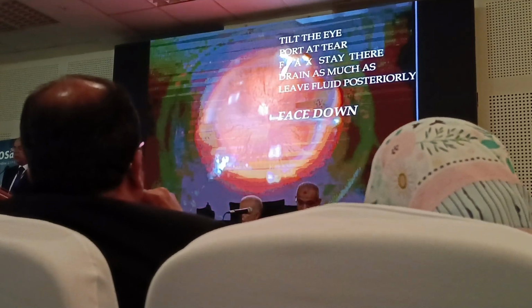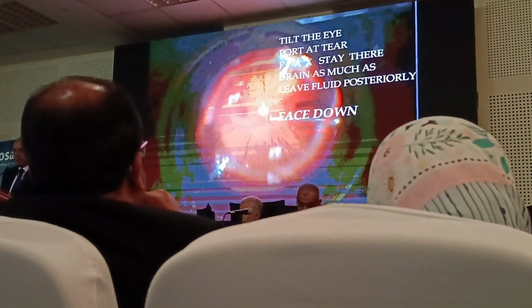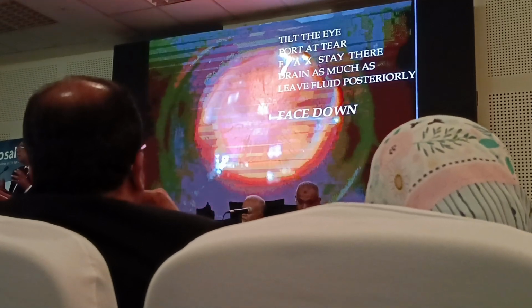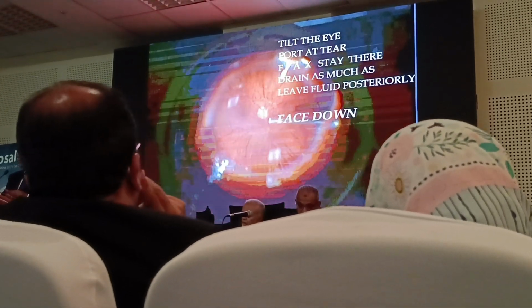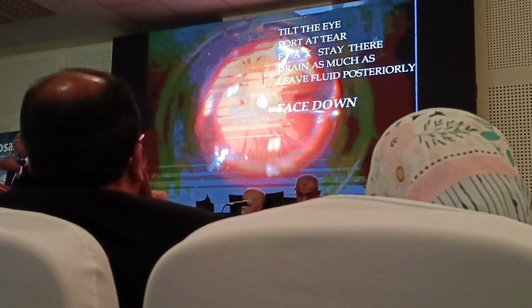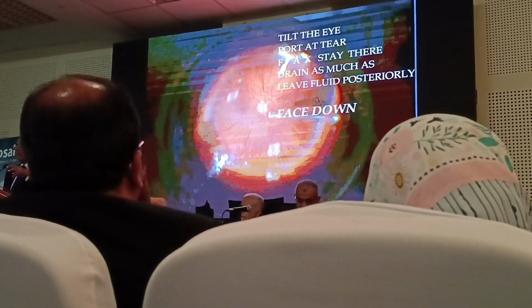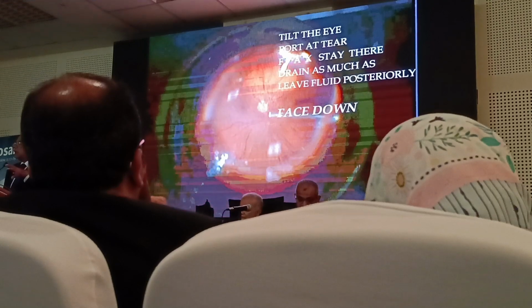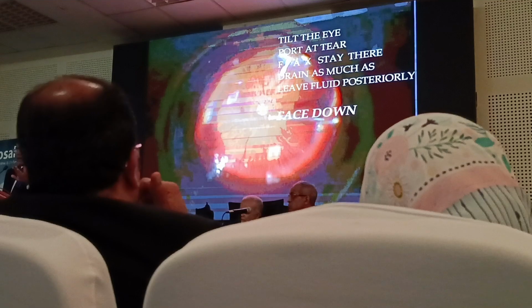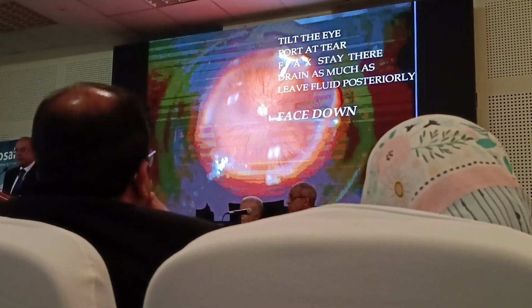You don't have to have a complete drainage, especially if you are going to leave the eye filled with gas. All you need is to have the tear in contact with choroid to perform laser. Fluid in the posterior part of the eye is not important. Perform laser, have a reasonable gas bubble, and let the patient have face down position for a while. This will push subretinal fluid out of the eye.